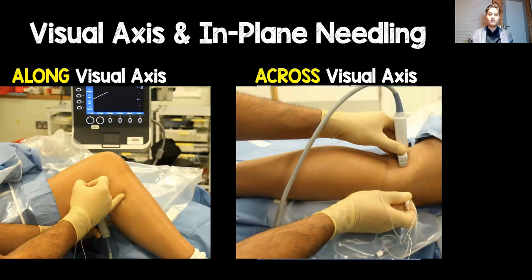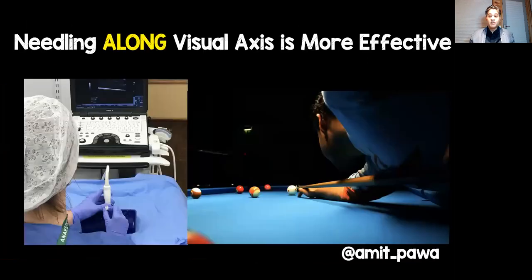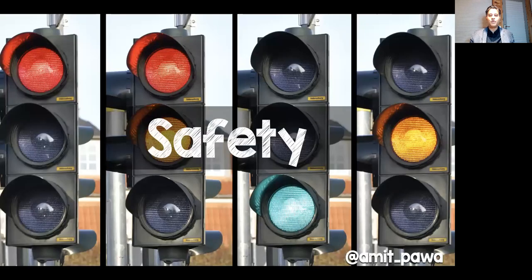Now, actually, when we've looked at some studies here, what it shows is actually needling along your visual axis makes more sense. It's a bit like trying to pot a ball, playing billiards or snooker or pool. You're much more likely to see what you're doing as opposed to needling across that view.